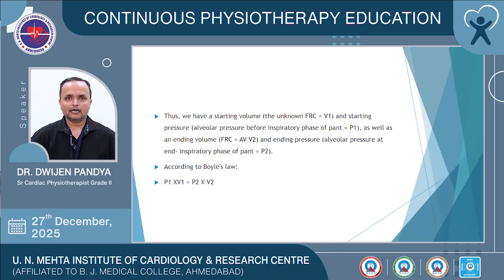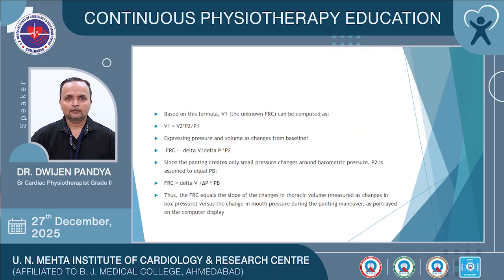Thus, we have a starting volume, the unknown starting volume, and the starting pressure, alveolar pressure before the inspiratory phase of the pant, as well as the ending volume and ending pressure, alveolar pressure at the end inspiratory phase of the pant. So according to Boyle's law, we know that P1 multiplied by V1 is equal to P2 multiplied by V2. Based on this formula, V1, that is the unknown FRC, the functional residual capacity, can be computed as V1 equal to V2 multiplied by P2 divided by P1.